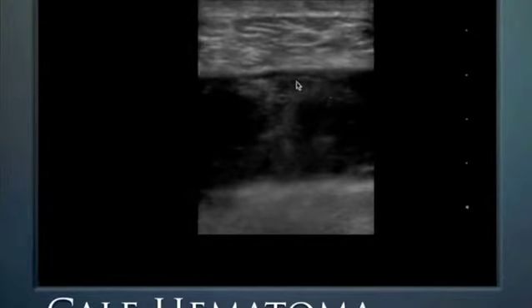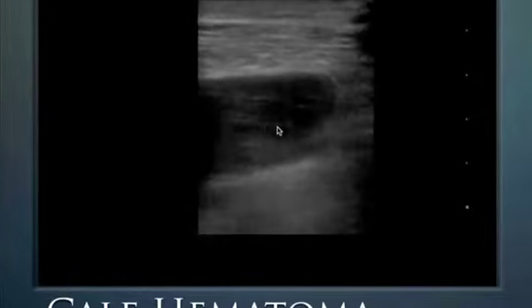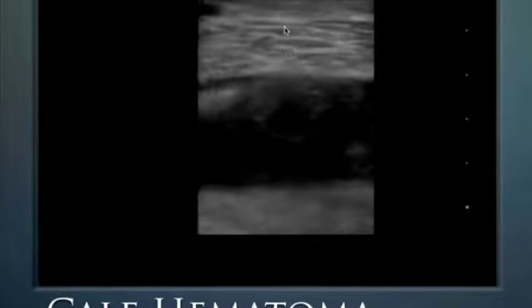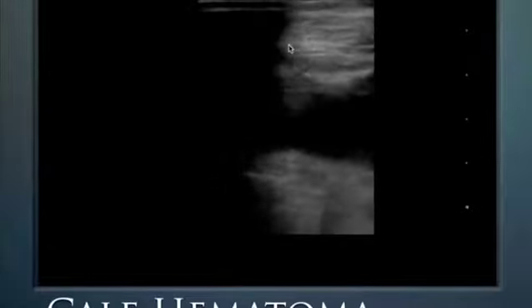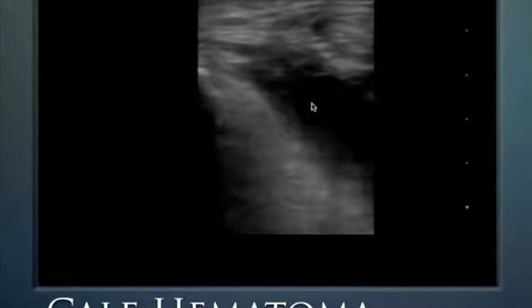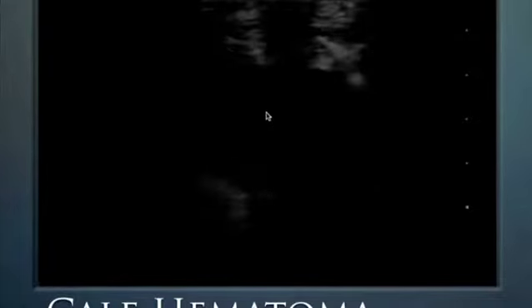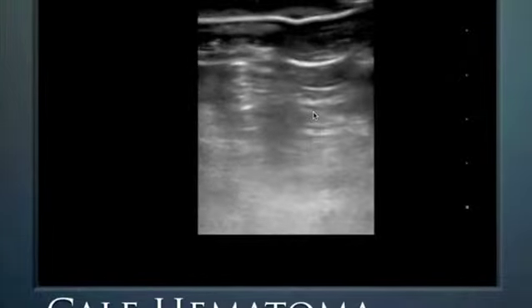And finally, some things look like abscess, but they're just hematomas, and that's what this looks like here. This is in the patient's calf. This is muscle we see up here, and this very hypoechoic area with some anechoic areas to it. This is what a calf hematoma looks like. It's all spreading out back here. And on the patient's skin too, there's prominent ecchymoses seen as well.